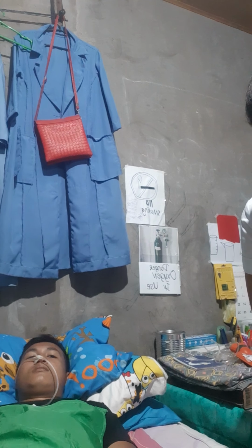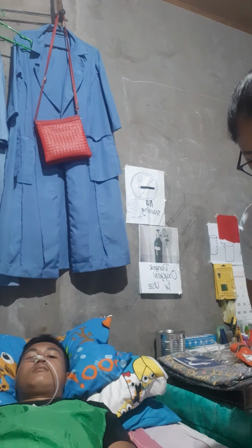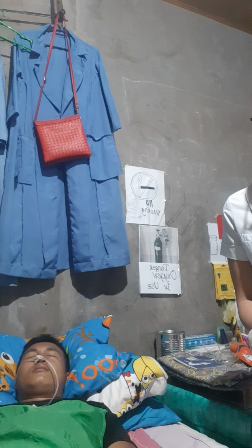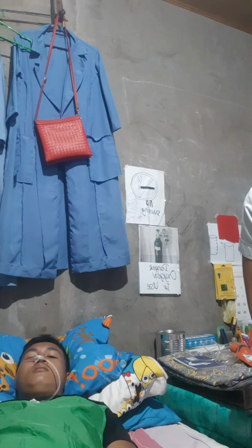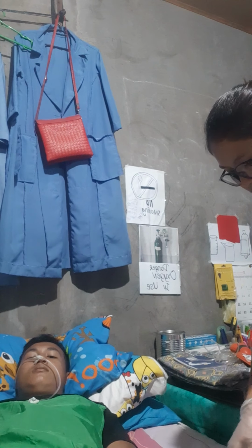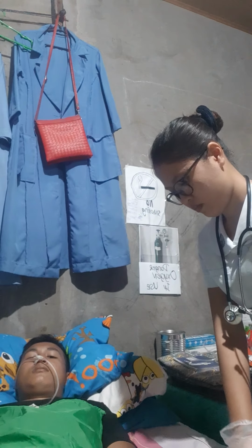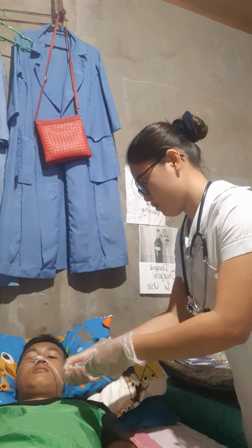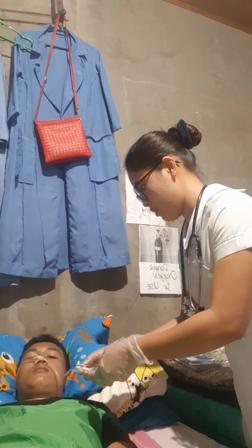So we are going to have the syringe. We need to aspirate.